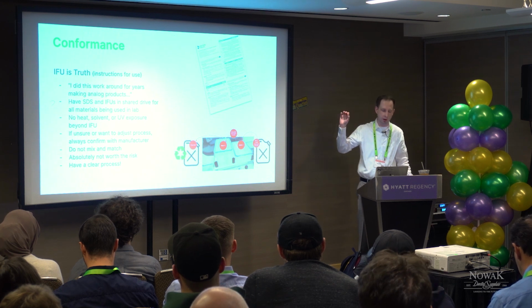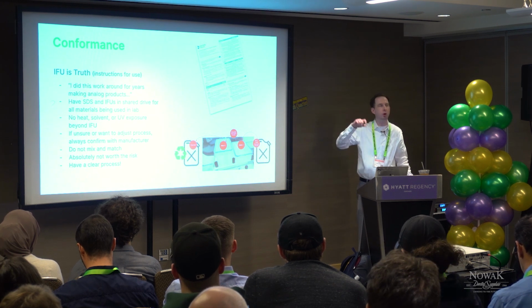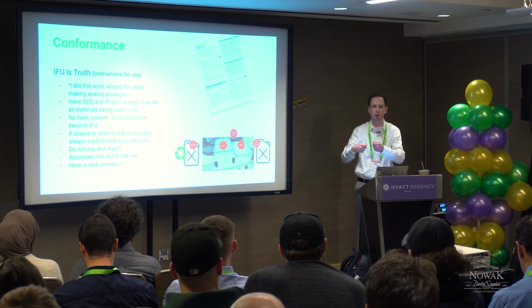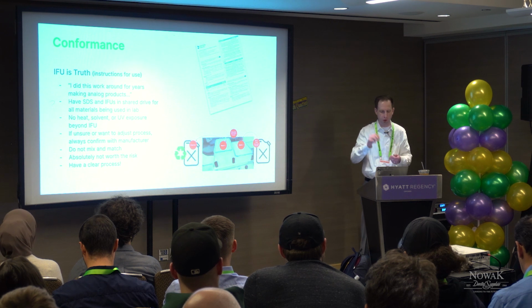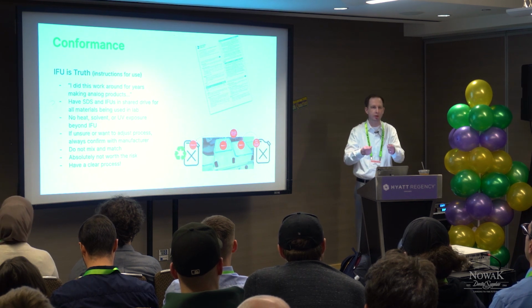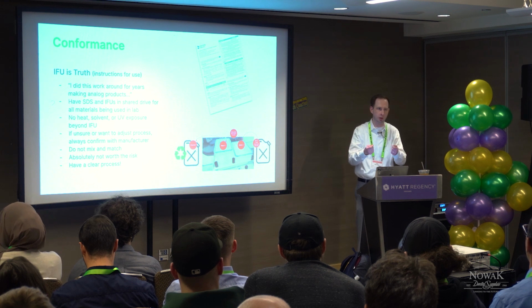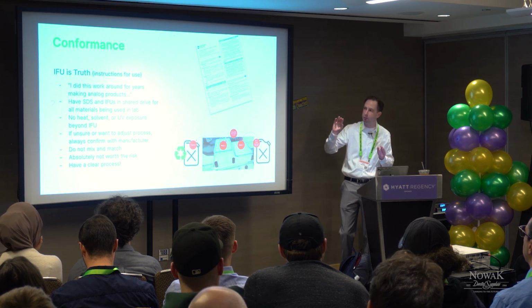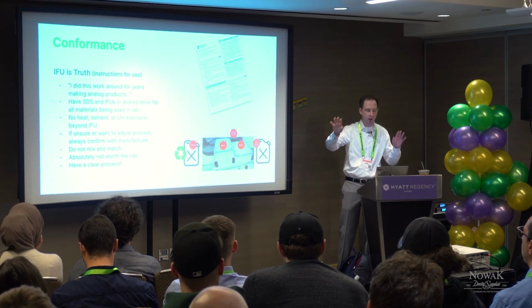And a big thing here is these GC OptiGlaze products and the like, where you need to post cure them for characterization. You're hitting that with additional UV energy. The more UV energy you put into a photopolymer or a thermoset, the more brittle it becomes. It's going to explode.